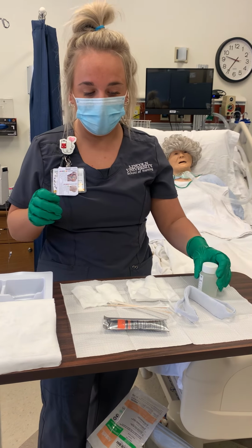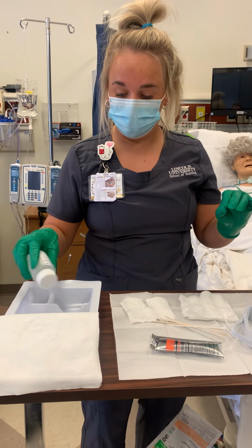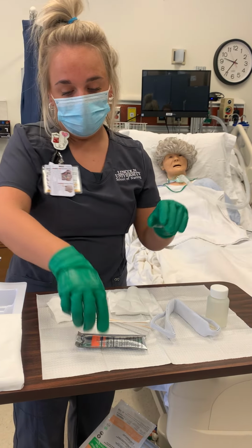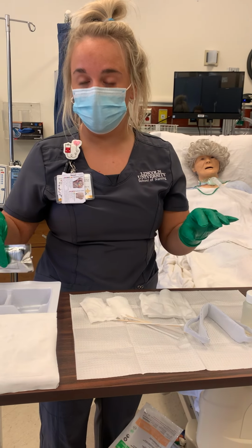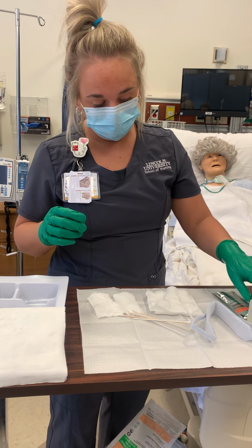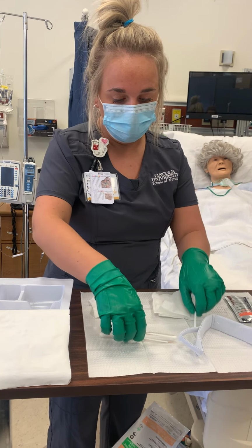Okay, so what I would do first, I'd go ahead and add the saline to all 3 compartments. So I would do that. And then I would take my hydrogen peroxide and just dump it into one, diluting it with that saline. And then make sure everything's set up for me the way I want it.